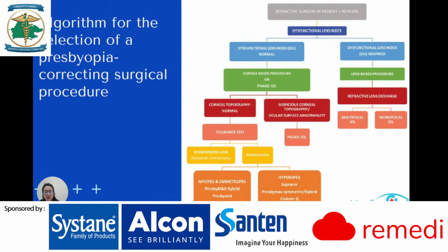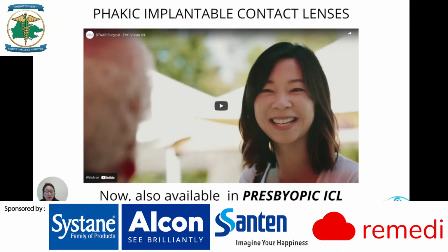If the dysfunctional lens index is impaired, patient will be counseled for a lenticular-based procedure such as a refractive lens exchange with a multifocal intraocular lens or a monofocal lens, utilizing a monofocal monovision. And this is a video on phakic implantable collamer lens, which is now also available with presbyopic ICL.